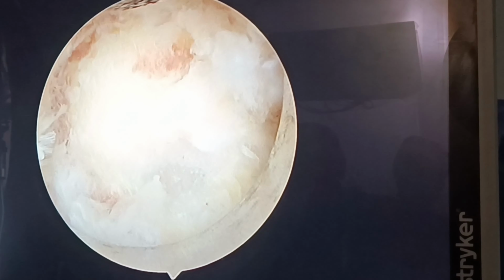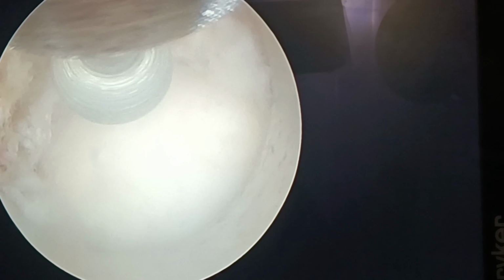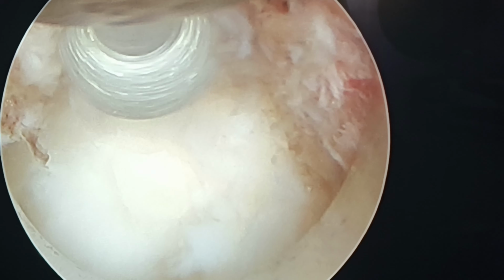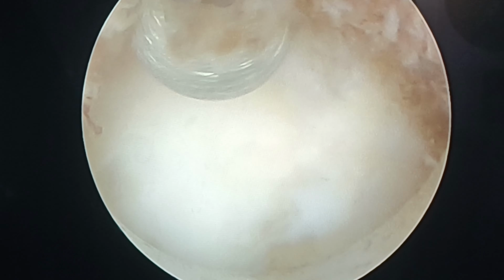I prefer not to touch ligament even though it starts coming. I just keep the ligament till the last part, till my bony work is complete, so I don't have to worry about inadvertent dural injury, and that way my work also is little faster. So this is towards the opposite side, that is on the right side, and towards the inferior side.